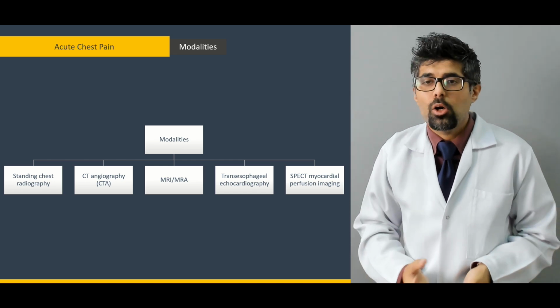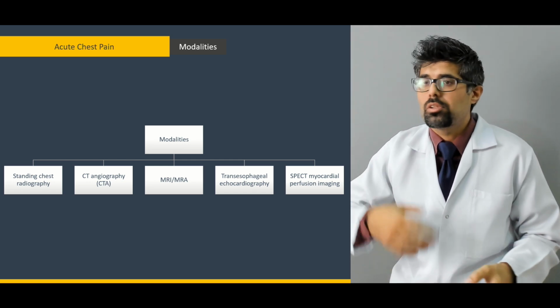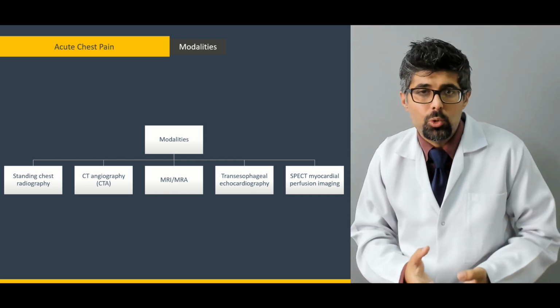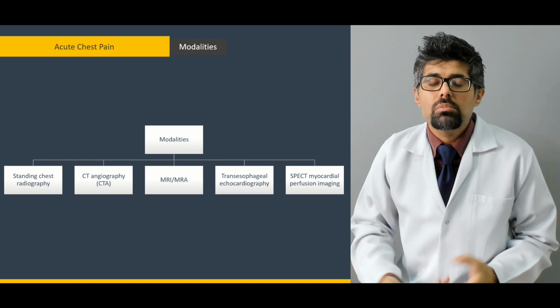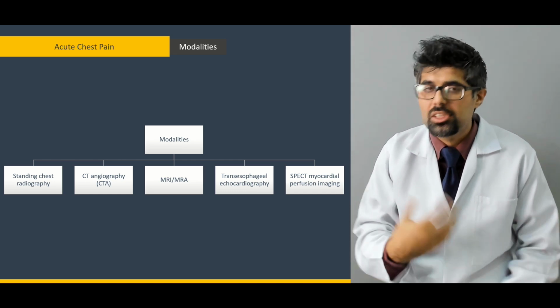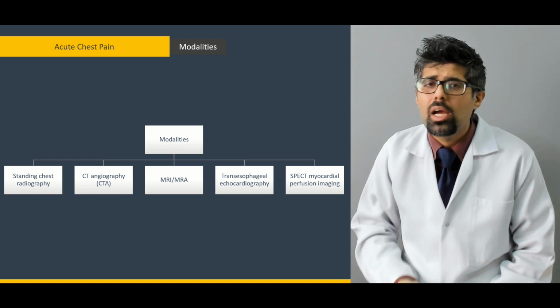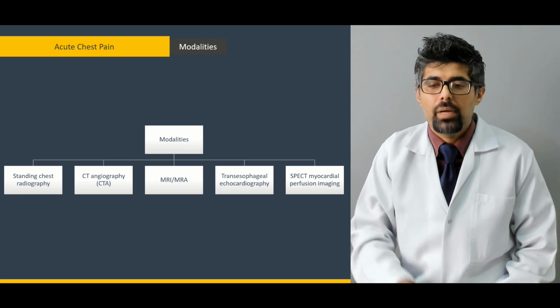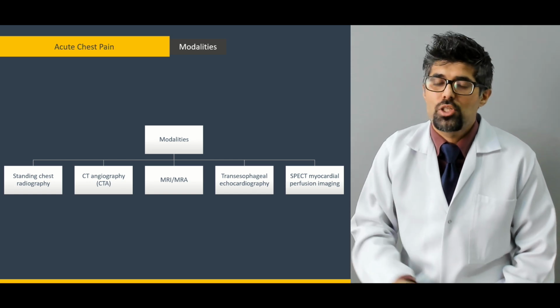The coronaries are good, the ventricles are good, the heart muscle is good, the tissue is good, but there might be something someplace that is compromised, that is abnormal. It might be a tiny mass or nodule. This can be picked up on a SPECT perfusion imaging study.